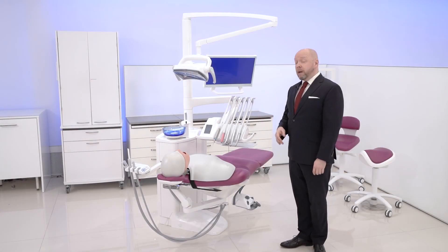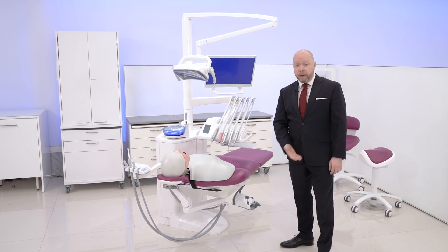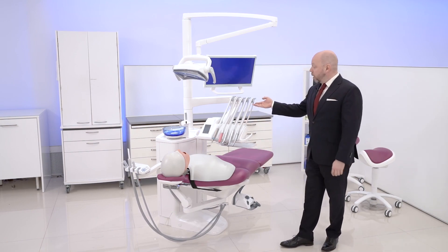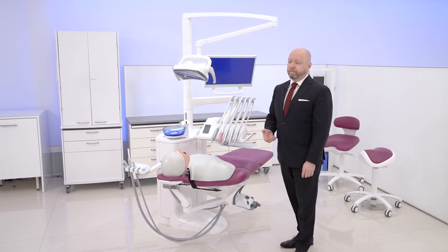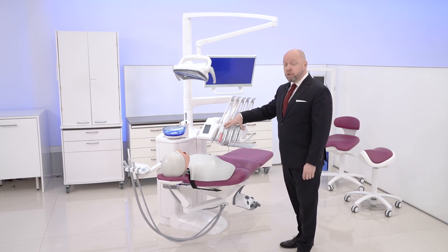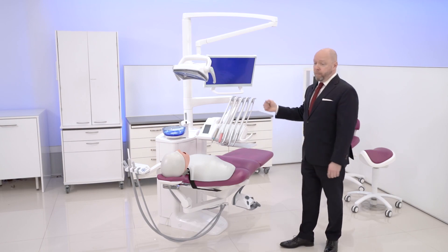We have many delivery arm options available: over the patient and side delivery, balanced arms and hanging hose, and cart. Today we're going to focus on our most popular model, the over-the-patient balanced arm option.